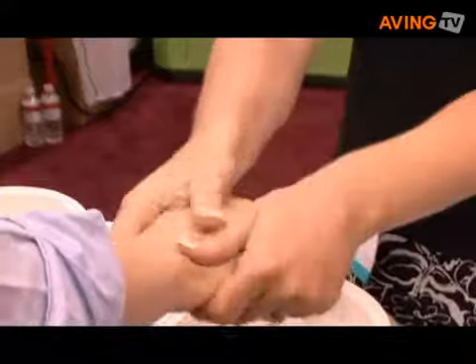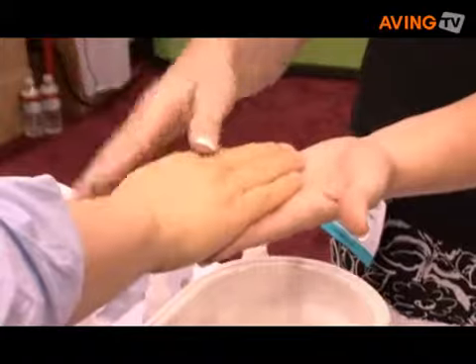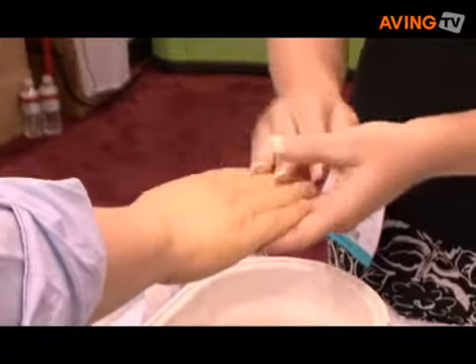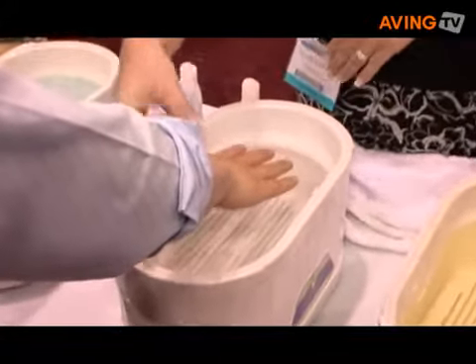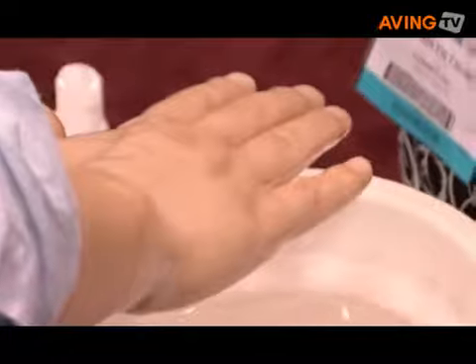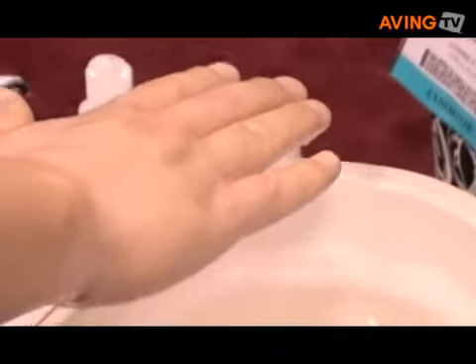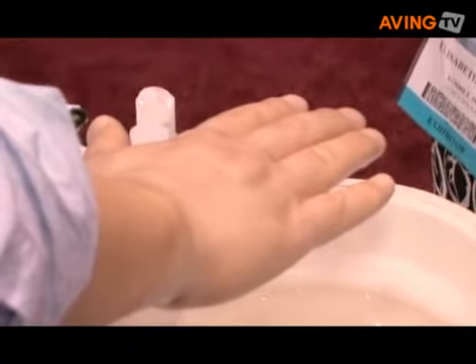When we do the paraffin dip, it'll actually open the pores in the skin and allow those products to penetrate into the actual skin. You're going to spread your fingers and dip your hand in the bath to the bottom of your wrist, then come right back out. Rather than keeping your hand in the bath, when you bring it out, the wax actually goes through a phase change — it will get a bit hotter as you take your hand out.